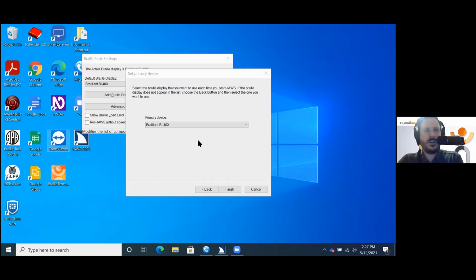So again, we want to read through our manual or our guide that Andrew and I spend a lot of time creating. Andrew put in a ton of work with screenshots and all sorts of things. We want to read through and learn these basic commands. But if we're just on the move or feeling like exploring, turning on keyboard help and then pressing something like dot 4 with space. Down arrow moves to the next line and speaks it. It will tell me what that does. So dot 4 with space, it says down arrow, move to the next line and speaks it.